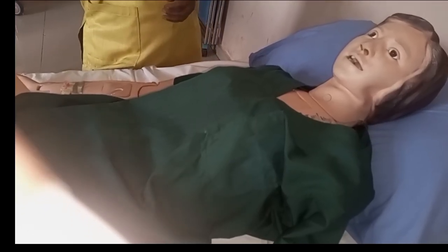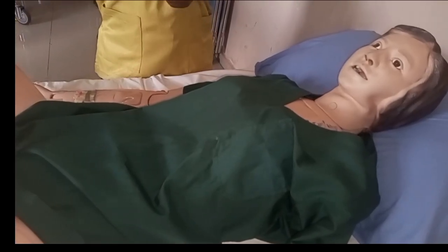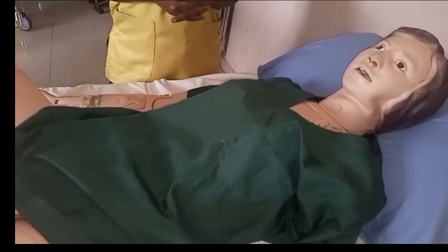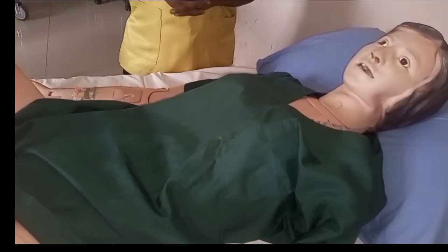'I'm going to use an antiseptic and a latex catheter to pass through your urethra to empty your bladder. Can you tell me your full name?' 'I am Helen Benedict.' 'Can you tell me your date of birth?' '15 March 1999.' 'Okay, so may I go ahead and perform the procedure?' 'Okay.' 'Thank you for consenting to this procedure.'